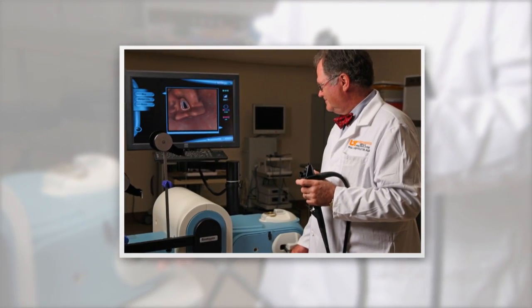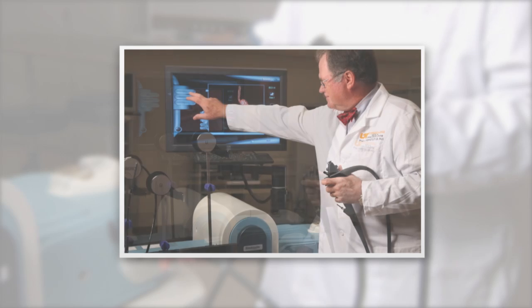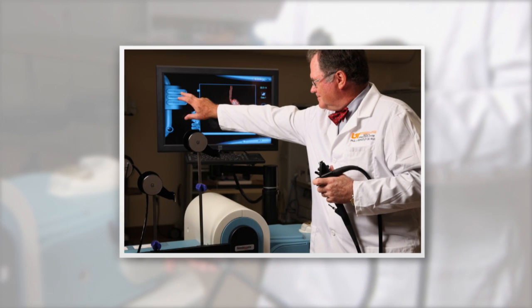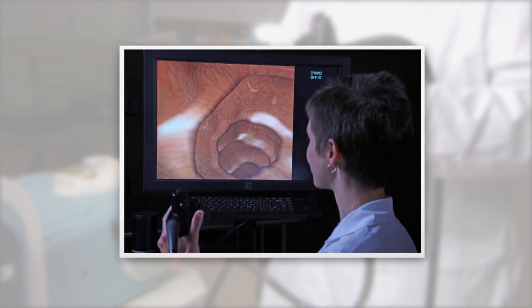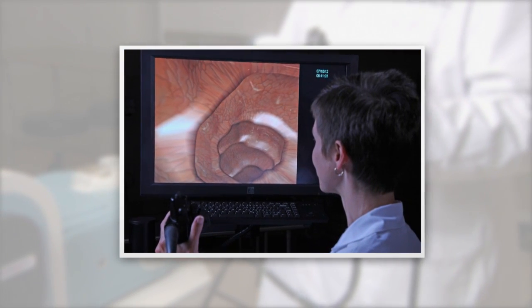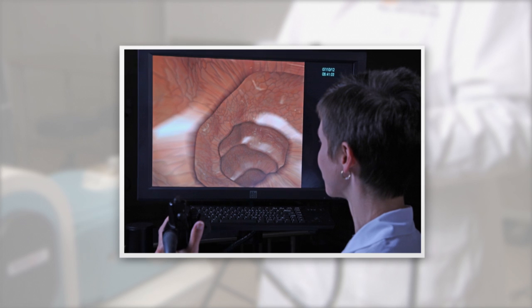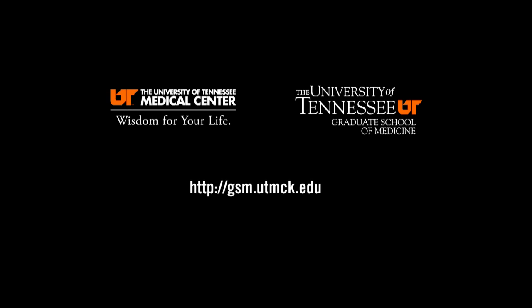The UT Center for Advanced Medical Simulation provides advanced virtual reality training with the established GI Mentor. For more information, visit gsm.utmck.edu.